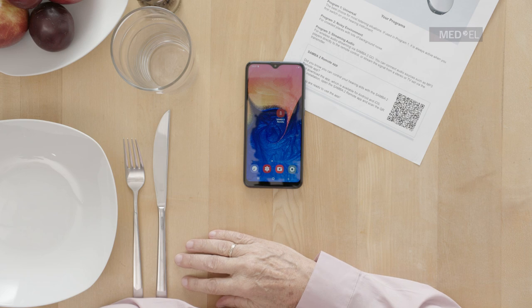The Samba2 Remote is an optional mobile app which can assist with switching between simple audio processor settings, as predefined by your audiologist or healthcare professional.